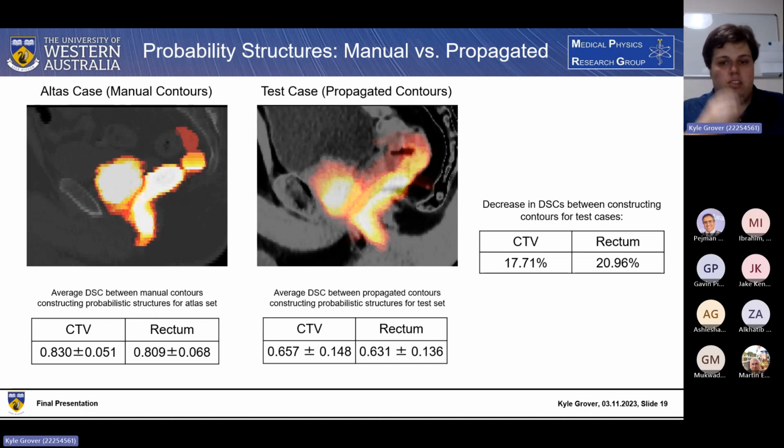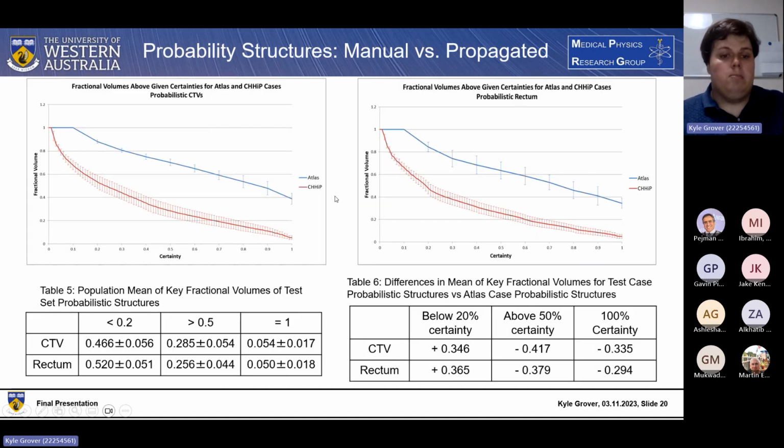This is primarily because we have small volumes and also enough variance so that they can achieve very good coverage, so we end up having a very small volume. So there's a very low amount that actually overlaps and has high agreement across all of these contours, as can be reflected by a comparison to here, where we have much larger regions of high certainty; we end up having it smaller. This is similarly summarized in these plots, which again compare those fractional volumes.